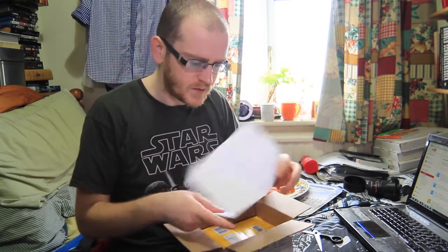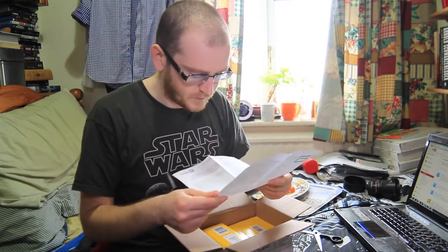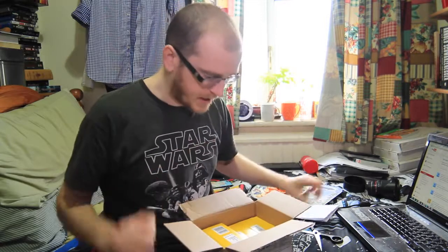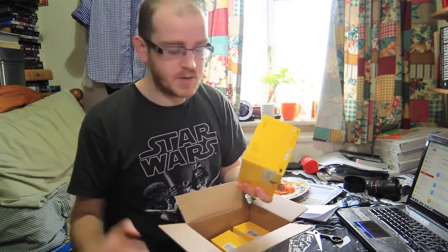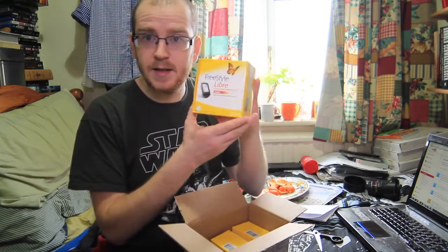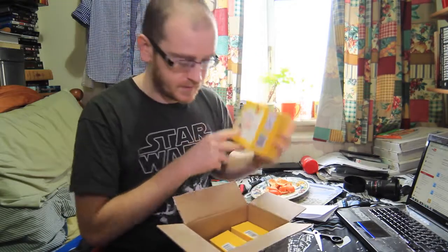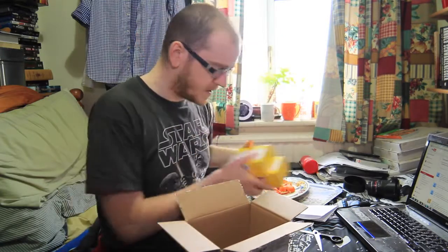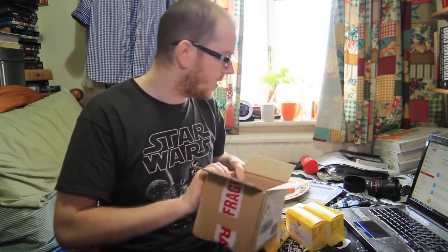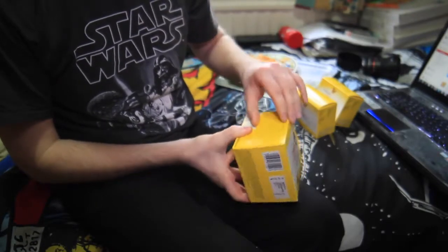So just opening it up now. Inside I have an invoice/delivery note, and three boxes. I've got my Freestyle Libre glucose monitor right here, my first Freestyle sensor, and my second sensor as well. That's everything — there's nothing else inside the box.